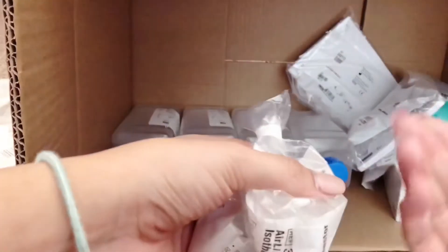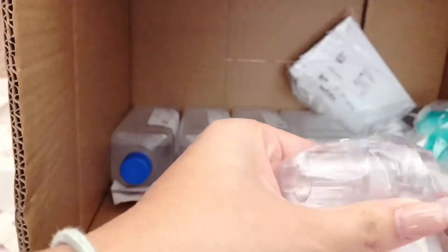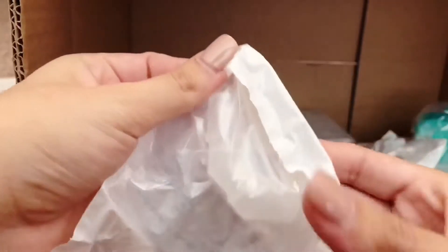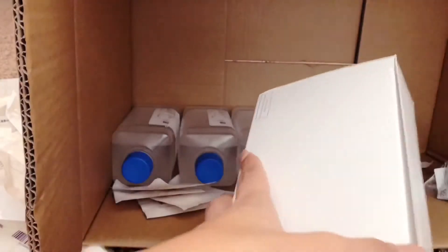These are Omni flexors — they let you bend the tubing. These are whisper valves — this is where Olivia exhales through. We get two of those. More Omni flexors — we do need those. There were also a couple of unknown items that I don't recognize, which they sometimes just throw in.